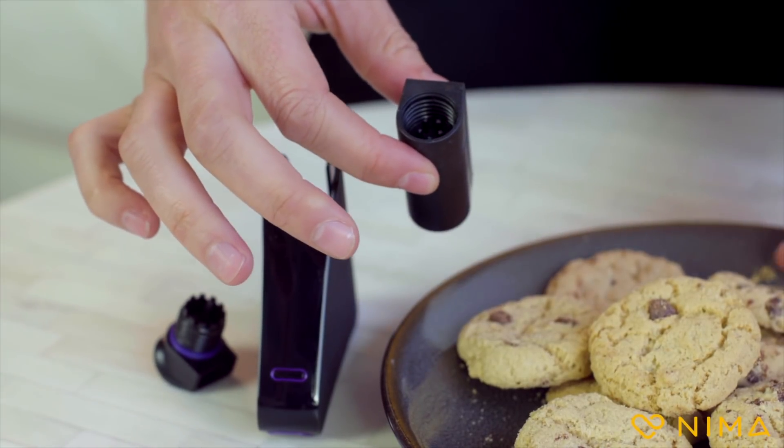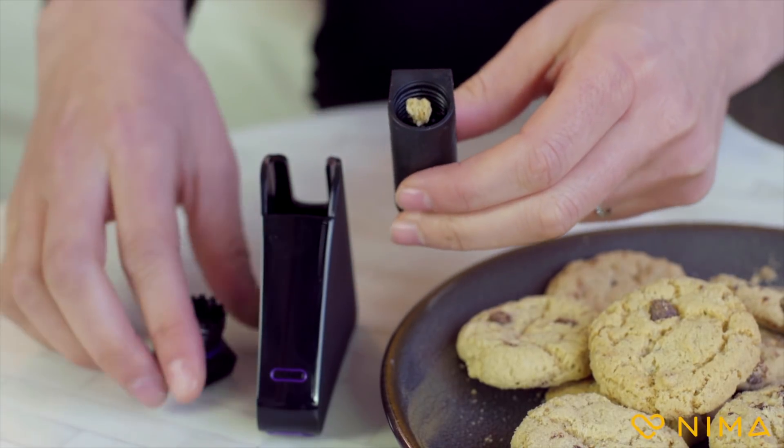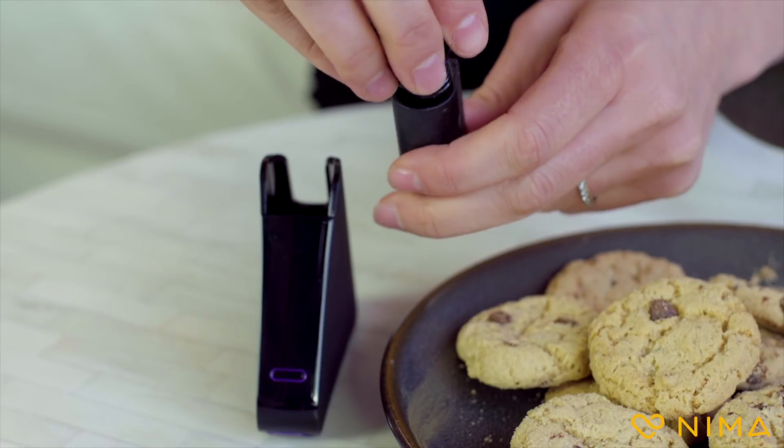First, take your Nima test capsule, then take a small sample of food — a pea-sized amount — and place it in the capsule. You can use your fingers or a utensil, and you can take a sample from different parts of the plate to make sure you get a little bit of everything. Now, close the capsule.